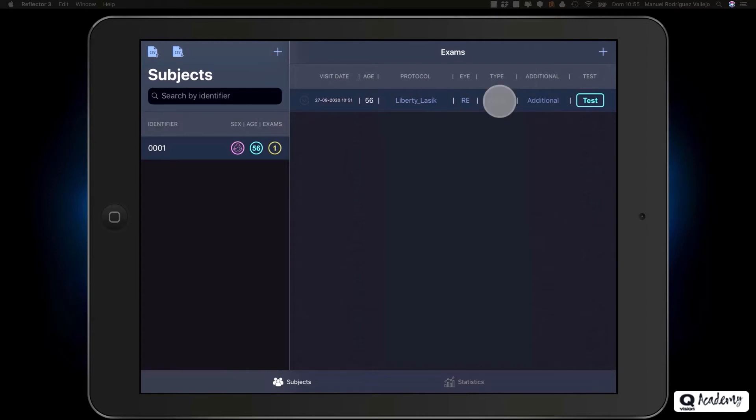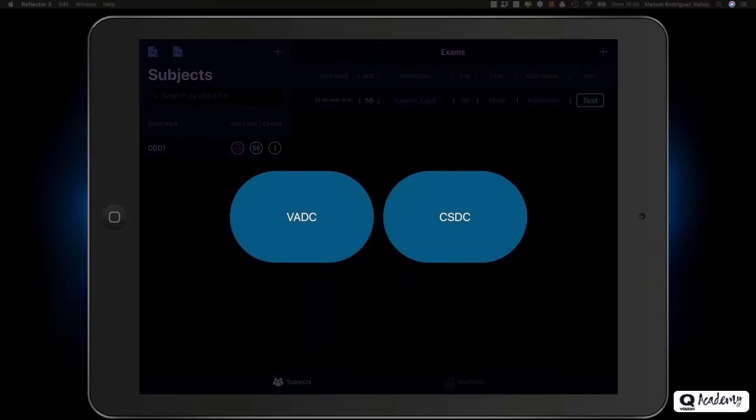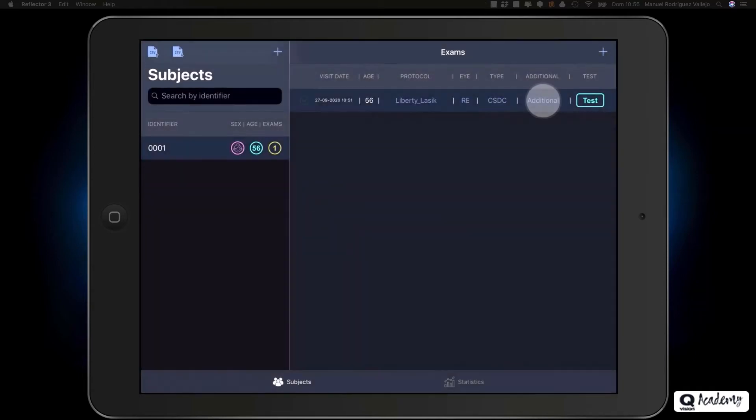Click none to select the exam type. For example, we are going to perform a contrast sensitivity defocus curve. Click on CSDC.